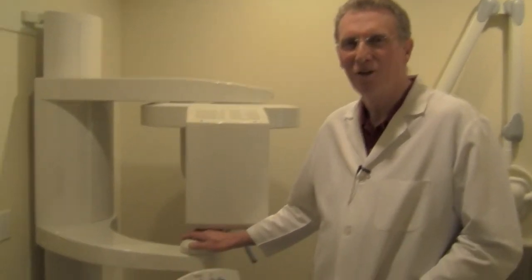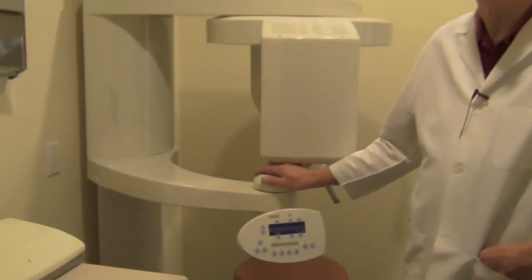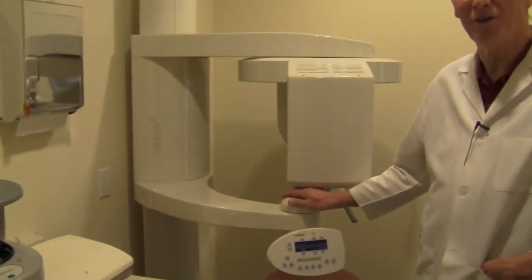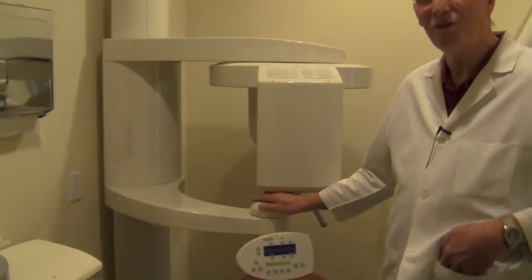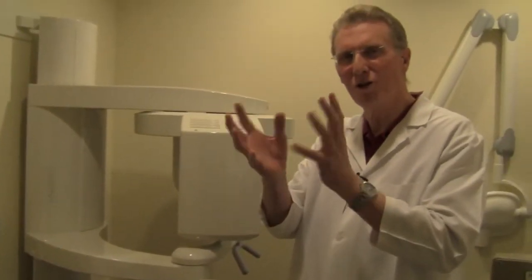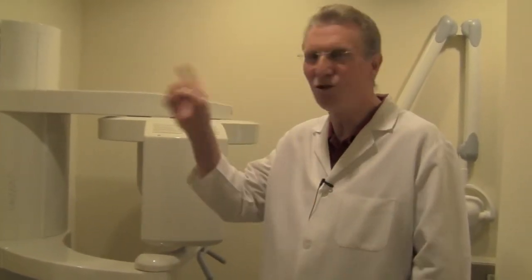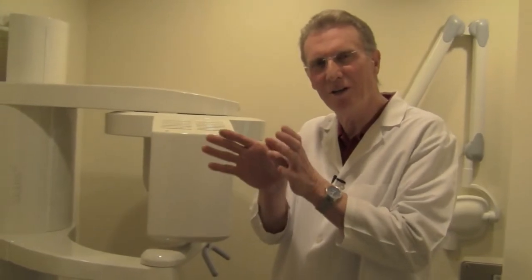This machine is the key to state-of-the-art implants. It takes a three-dimensional x-ray of the area where the implant is to be placed. That allows me to look at the bone from three dimensions and digitally place an implant in the x-ray. I can record that on a disc and send it to Germany, where they make a guide that fits in the patient's mouth when we place the implant.